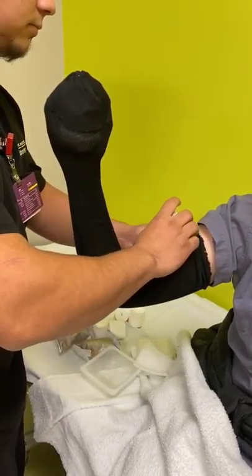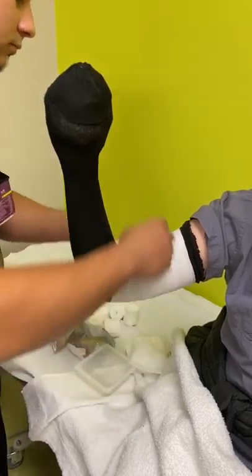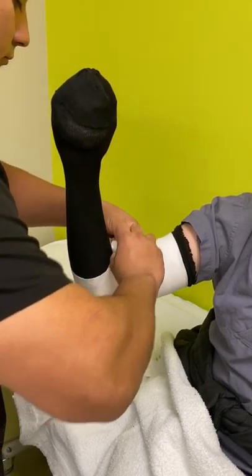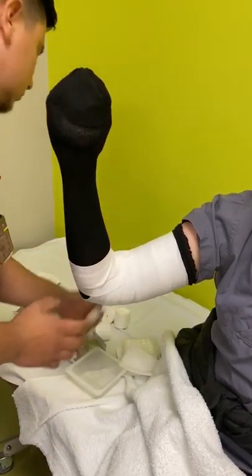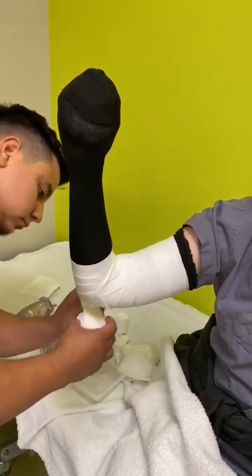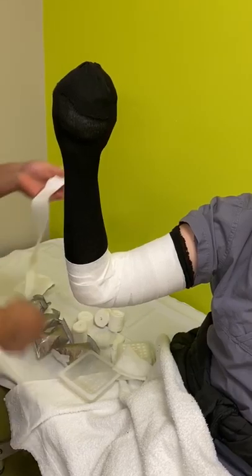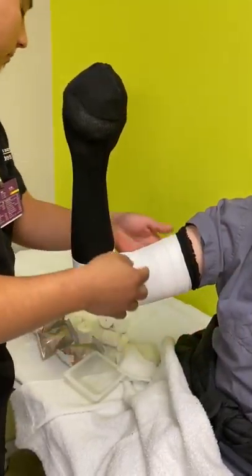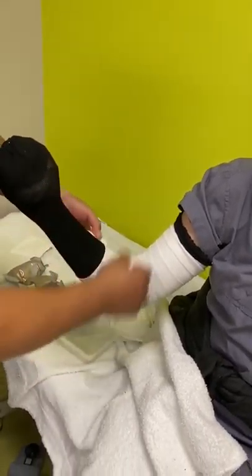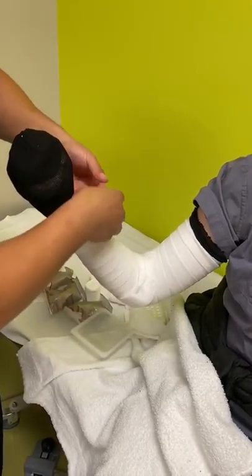He's now using the web roll, starting up at the upper arm, giving a couple layers at the cuff and a 50-50 roll down through the elbow and up the forearm. He's putting additional half layers of web roll around the elbow to pad the bony prominence of the olecranon, medial, and lateral epicondyles. He's then getting a piece and folding it in half to make a good cuff on the upper part of the cast. And now he's going through the forearm part of the cast.